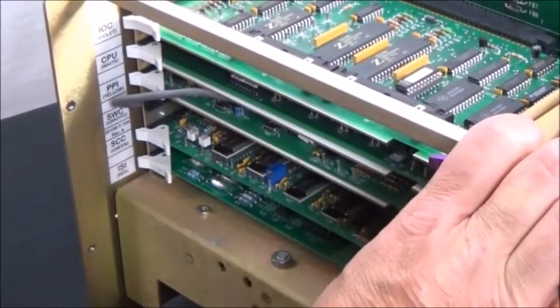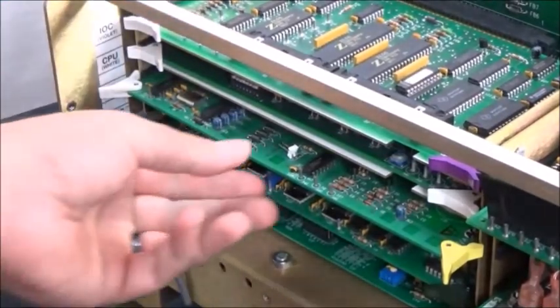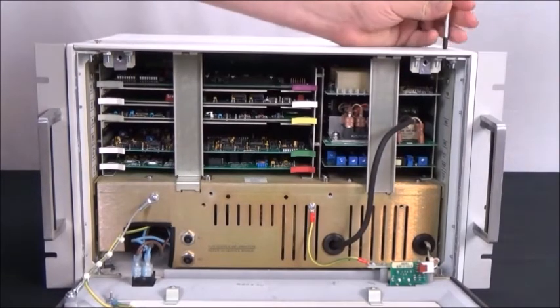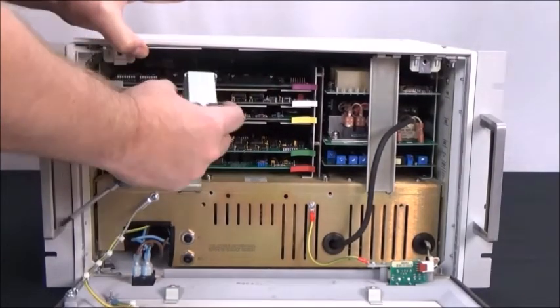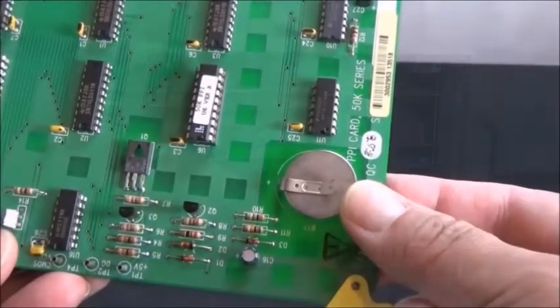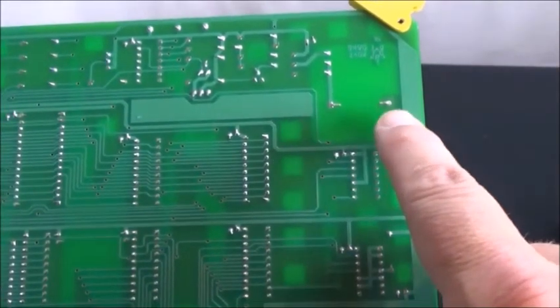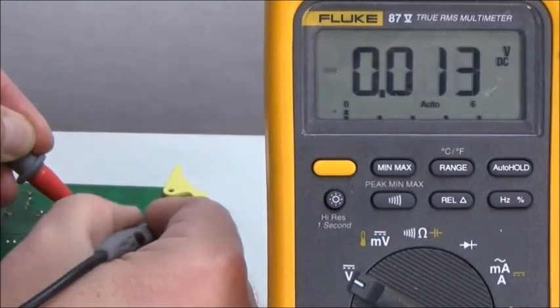Remove the pre-programmed injection or PPI board. If this is a rack mount system, there may be a retaining bar in the way. If so, loosen the 2 screws on the top of the rack and pull out the retaining bar. You can now measure the voltage of the 3-volt DC battery on the PPI board on the 2 posts of the battery on the back of the board. The voltage should be greater than 2.6 volts DC.